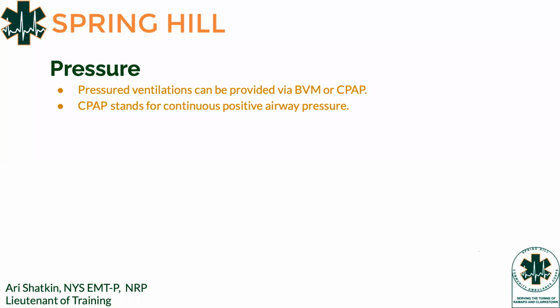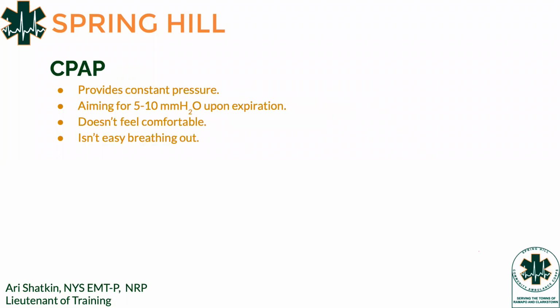But a lot of people think, okay, I'll use a CPAP for that, but that's not the case. It's not indicated. You'd still use BVM ventilations for that. So CPAP's goal is to keep the airway open with positive pressure. It's like forcing everything to dilate, like blowing up a balloon. So you're blowing up a balloon, everything dilates from that. It then keeps the airway open by providing continuous pressure.